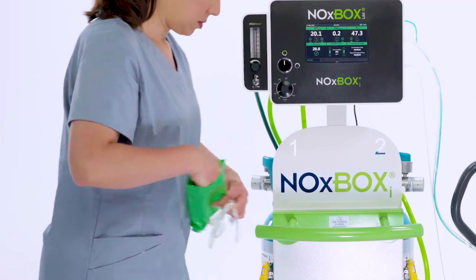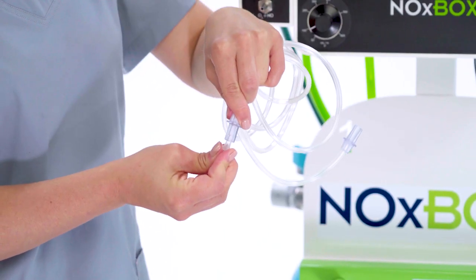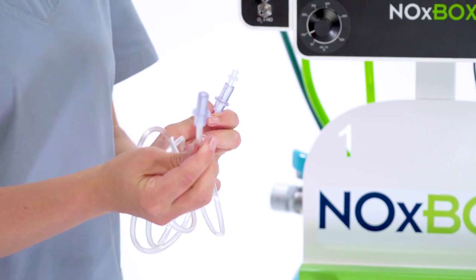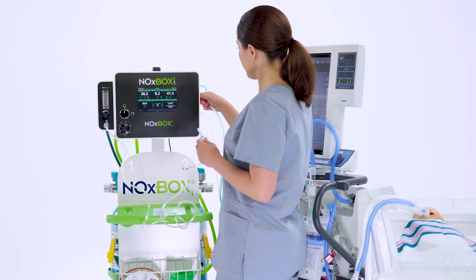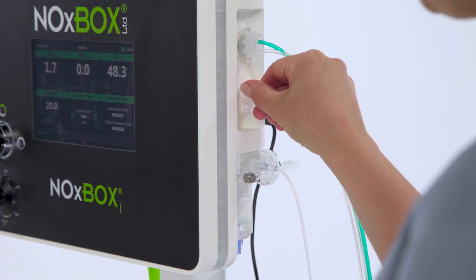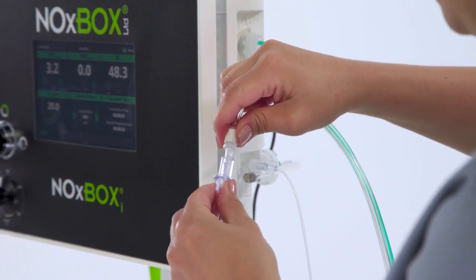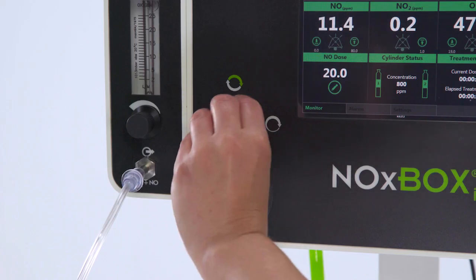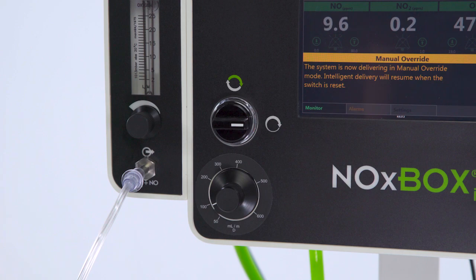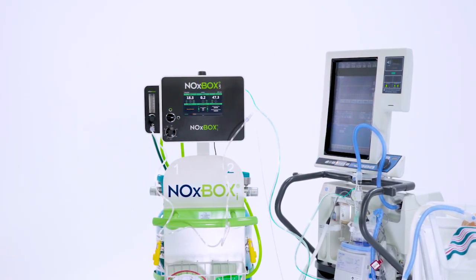Remove the NOx emergency backup kit from its packaging and assemble the luer connection. Connect the tubing to the NOx mixer outlet barb. Remove the nitric oxide dose line from the port on the NOxBOXi device and connect it to the emergency tubing using the luer lock. Rotate the mode selection valve to the manual override mode for bagging, emergency backup, or Neopuff circuit use.